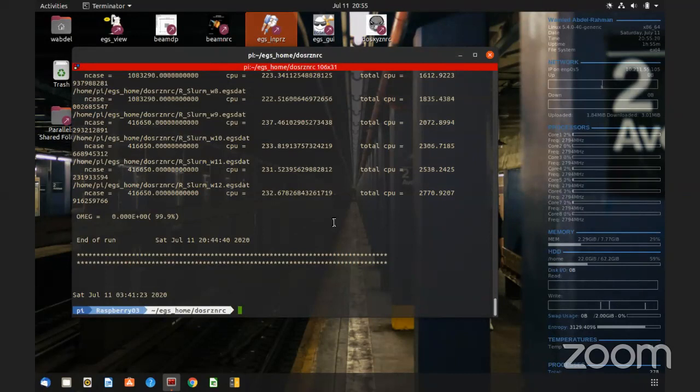And by the way, what's the expected total time of simulation? If you're expecting this to finish within, let's say, a day, I would just ditch everything and run it again. But if this is going to be 4 or 5 days, yeah, then it was working from the last 3 days, and it may take around 2 more days to finish that simulation.